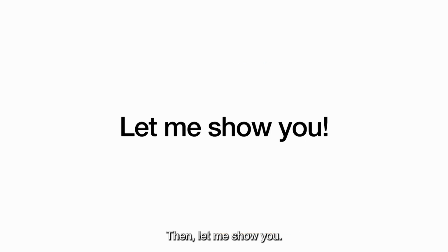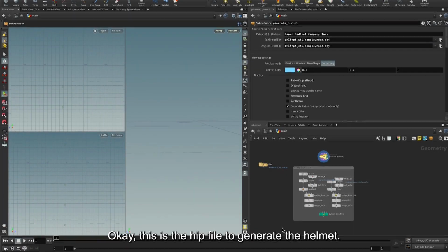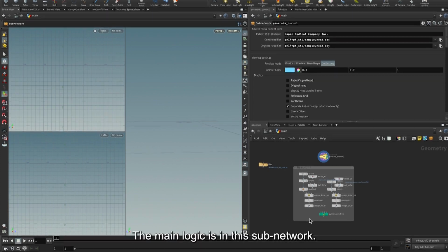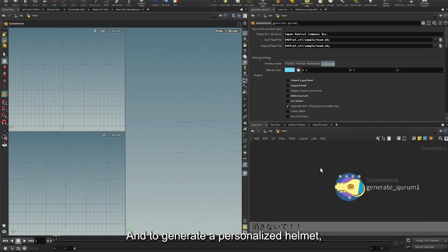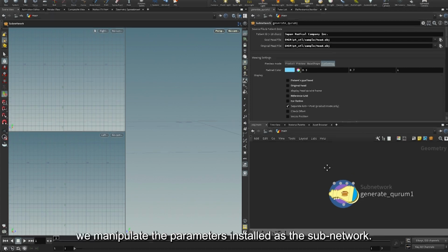Then let me show you. Okay, this is a HIP file to generate the helmets. I'd like to talk about the structure of the HIP file. The main logic is in this subnetwork. And to generate the personalized helmet, we manipulate the parameters exposed on the subnetwork.